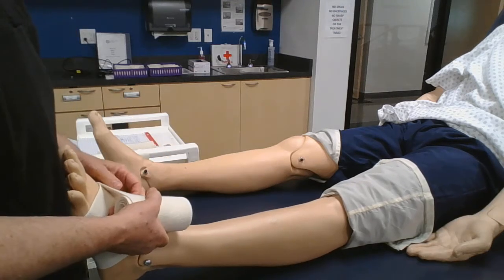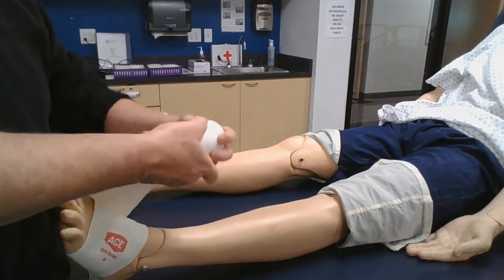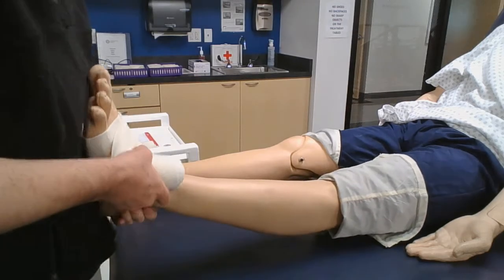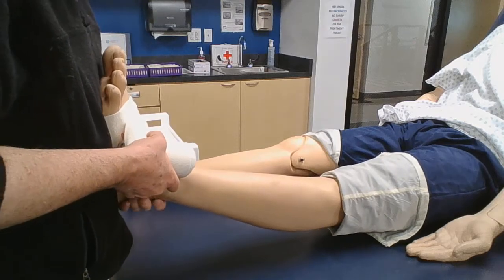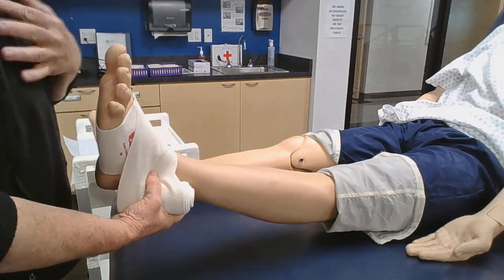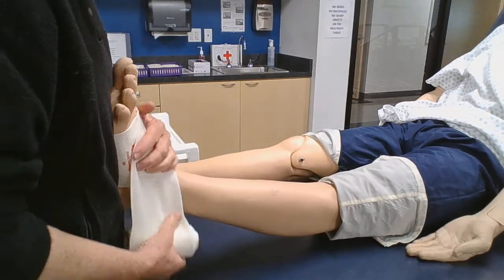The other thing, you guys, when you're holding on to the roll, don't get way out here, okay? You can't control how much pressure you put on, or how much stretch, I should say. Now I've just done a lot of athletes. I often have them, so I know it's in their ankles in dorsiflexion, I often have them here. I put a towel over my shoulder so that their nasty little toes are not on my clothing. But everybody does that differently.